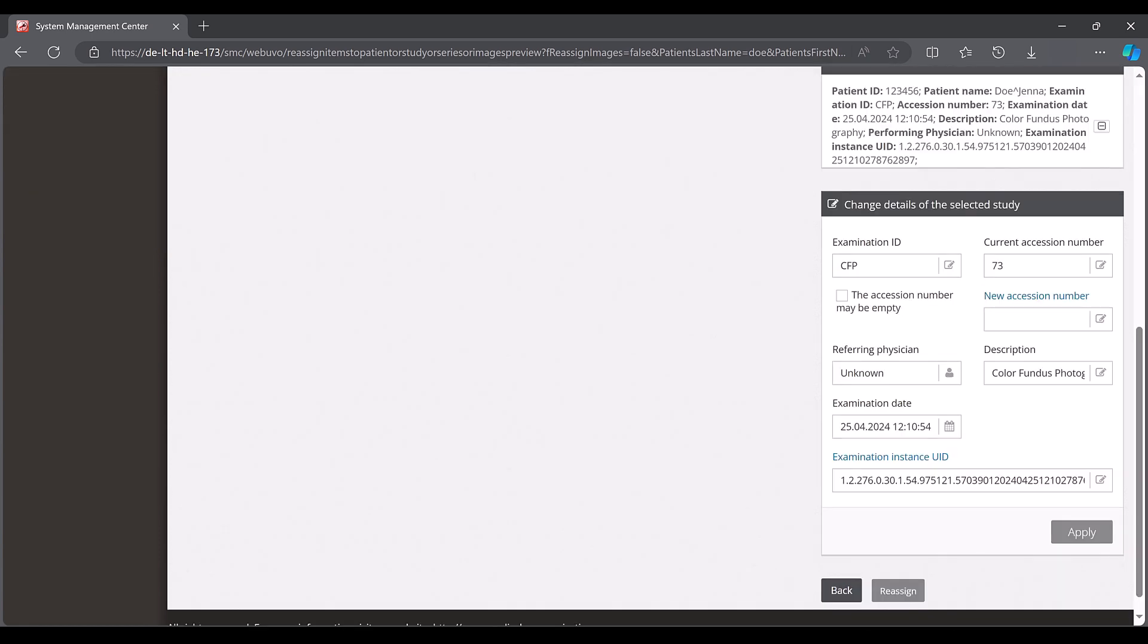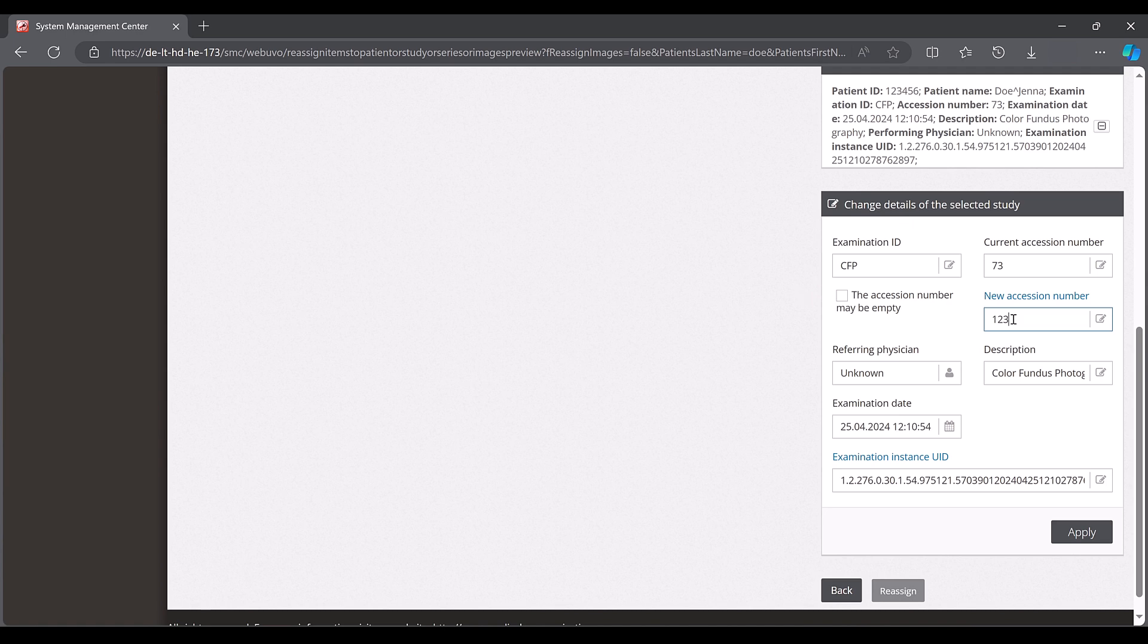You may have to scroll to get to the lower part of the dialog. Enter an accession number in the change details of the selected study area or activate the accession number may be empty checkbox. Confirm with apply and then click on reassign.